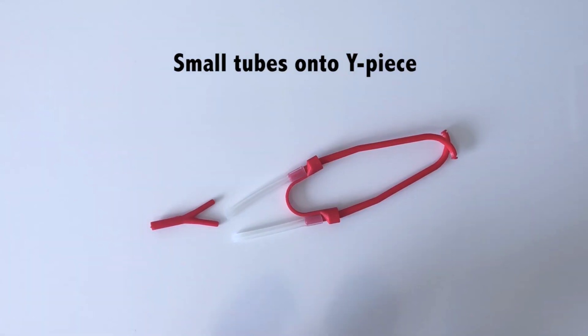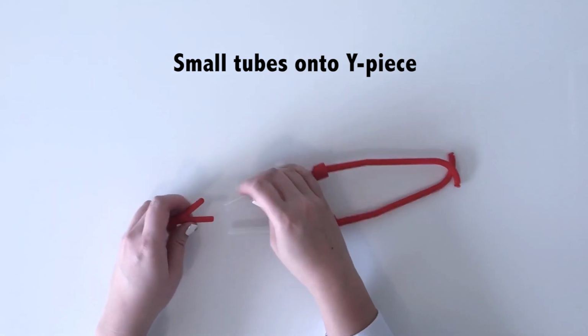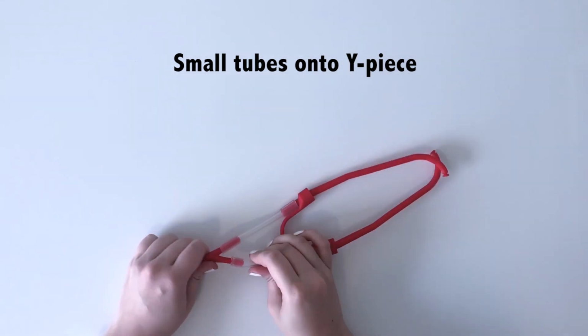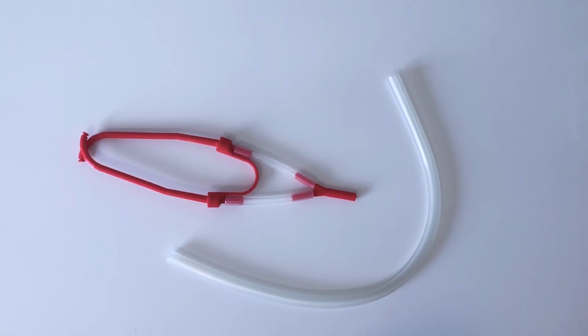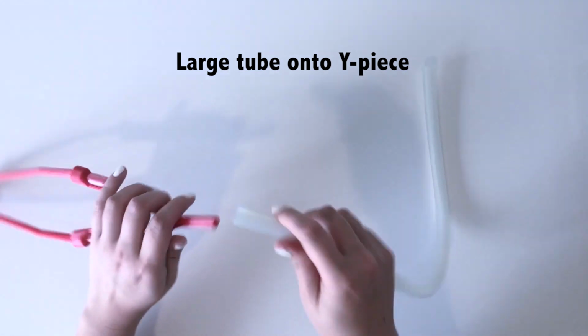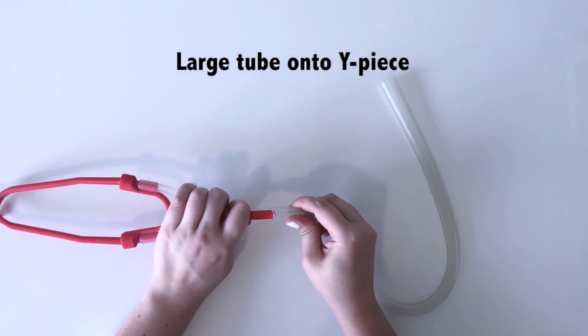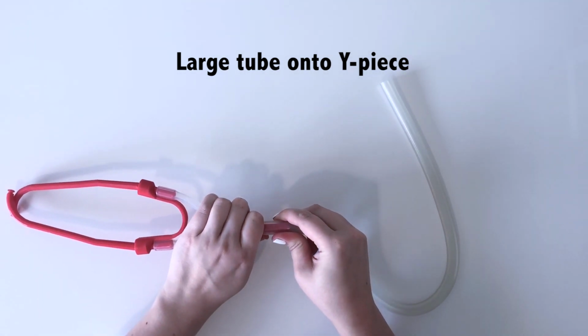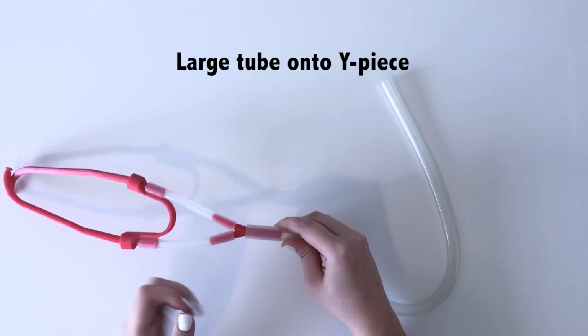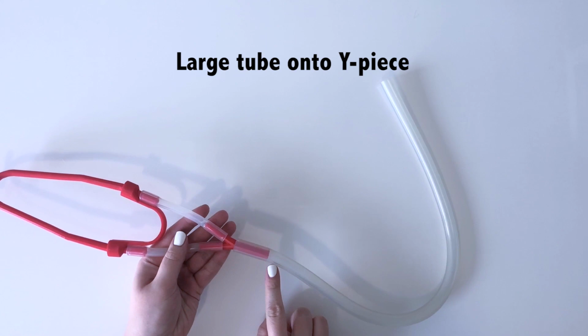Now, push the small tubes onto both ends of the Y piece. Take the large tubing and push it onto the other end of the Y piece. This is approximately how high the tubing should be.